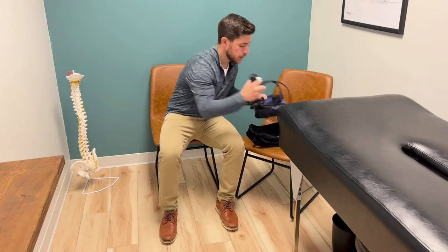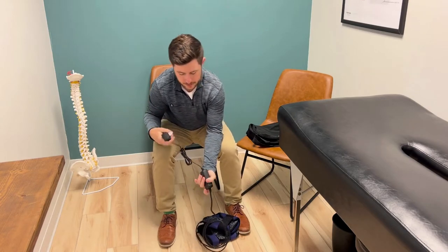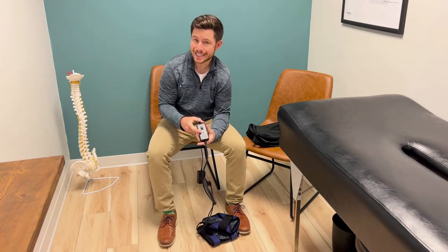As we start out, first and foremost, step number one is make sure to plug it in. After you plug it in, if we cruise down the wire here, what you're going to see is an on-off switch. As you turn it on, there's going to be a green light that turns on.